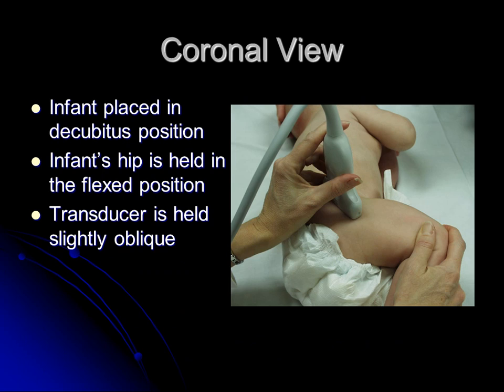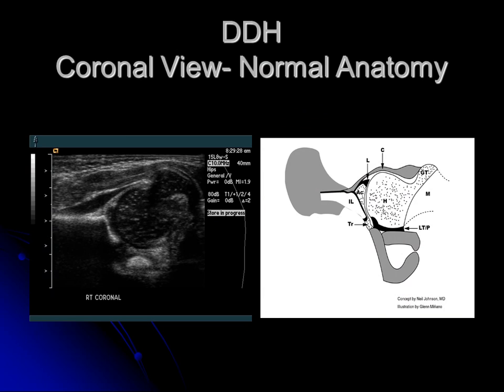This is an example of obtaining the coronal view. The infant is placed in the decubitus position, the hip is flexed, and the transducer is held slightly oblique. I'll show you an example of normal anatomy. To our left is the ultrasound image, and to the right is a schematic to help with orientation. The infant's head is to our left and feet are to our right. This is the iliac wing, and this is the ossified portion of the acetabulum. I have arrows pointing to the corresponding schematics just to help orient you on the image.